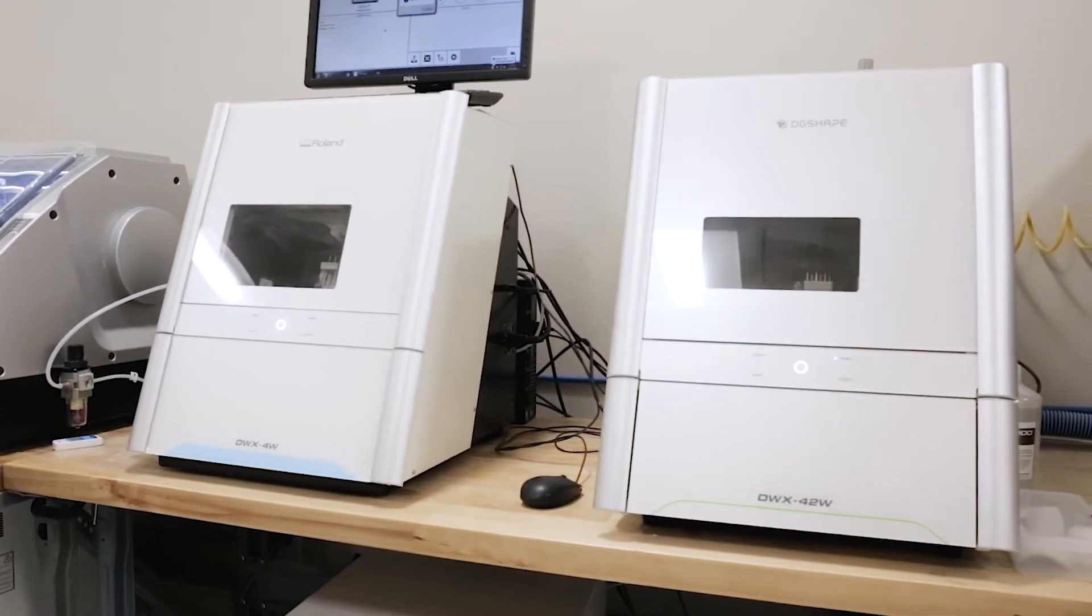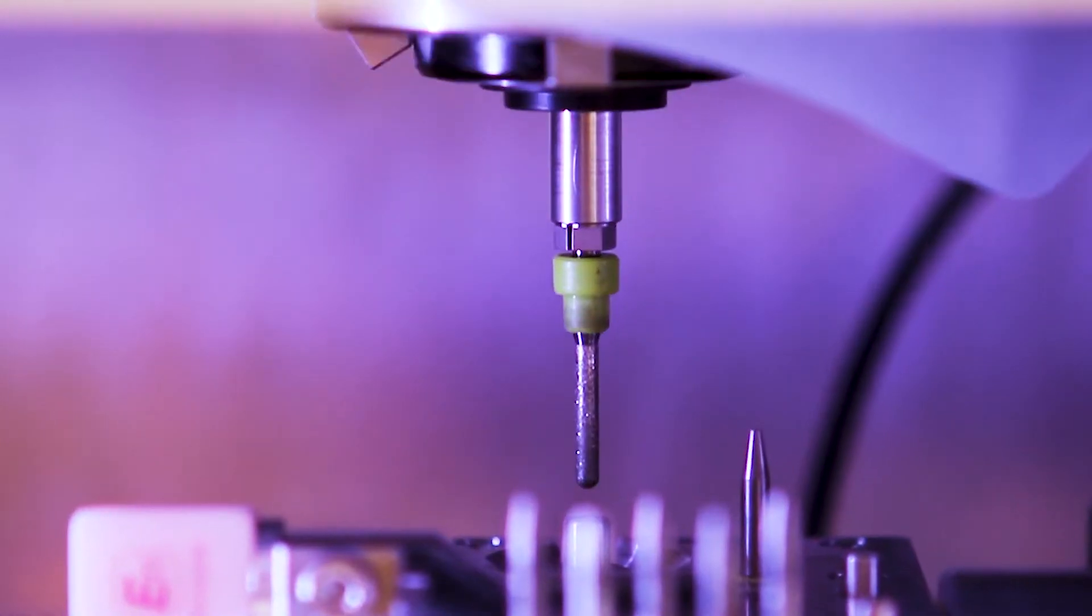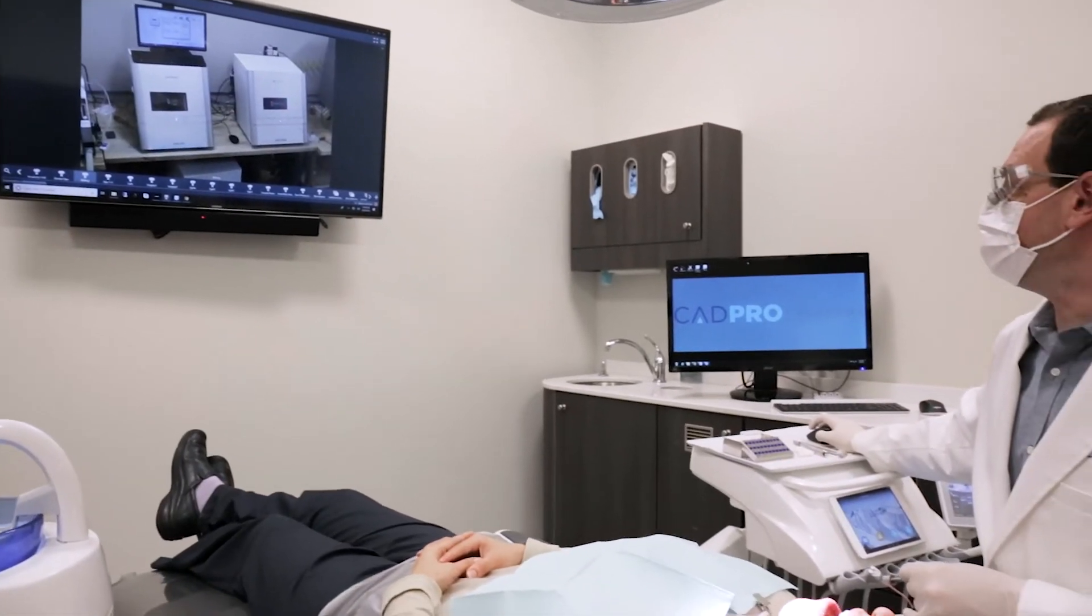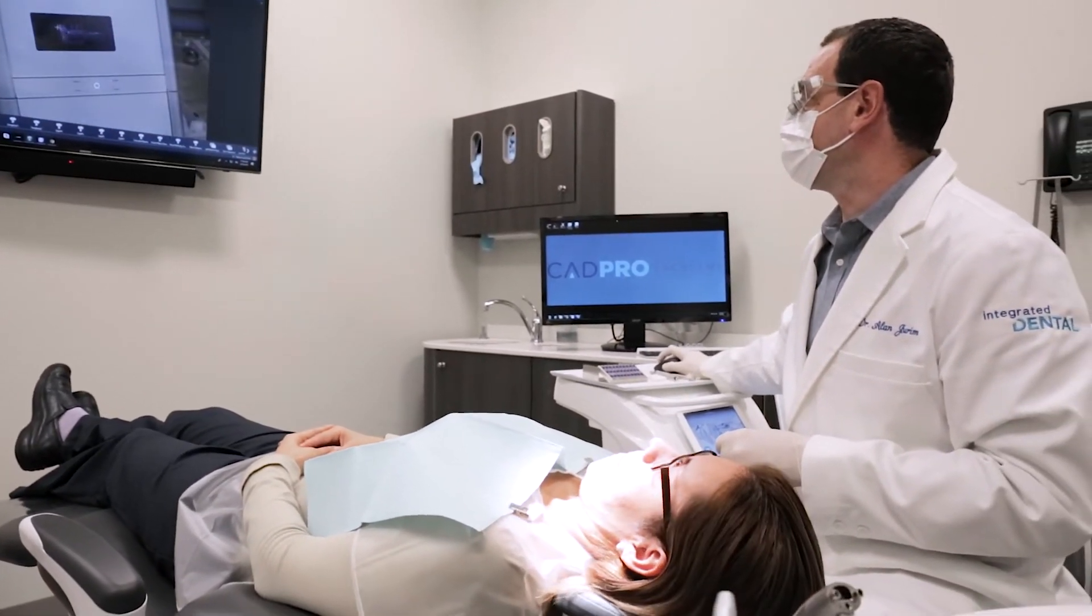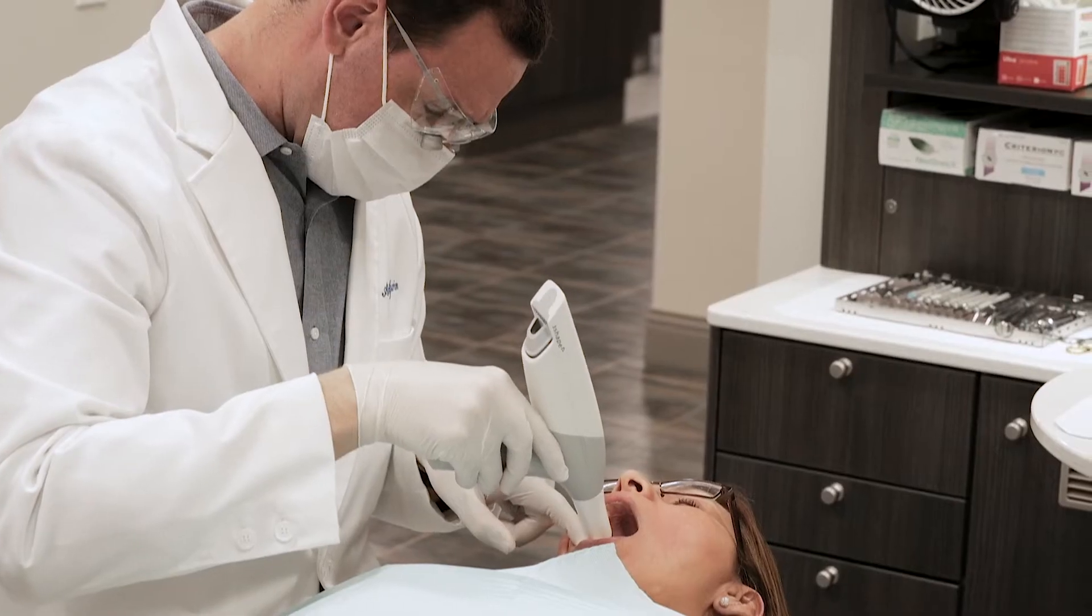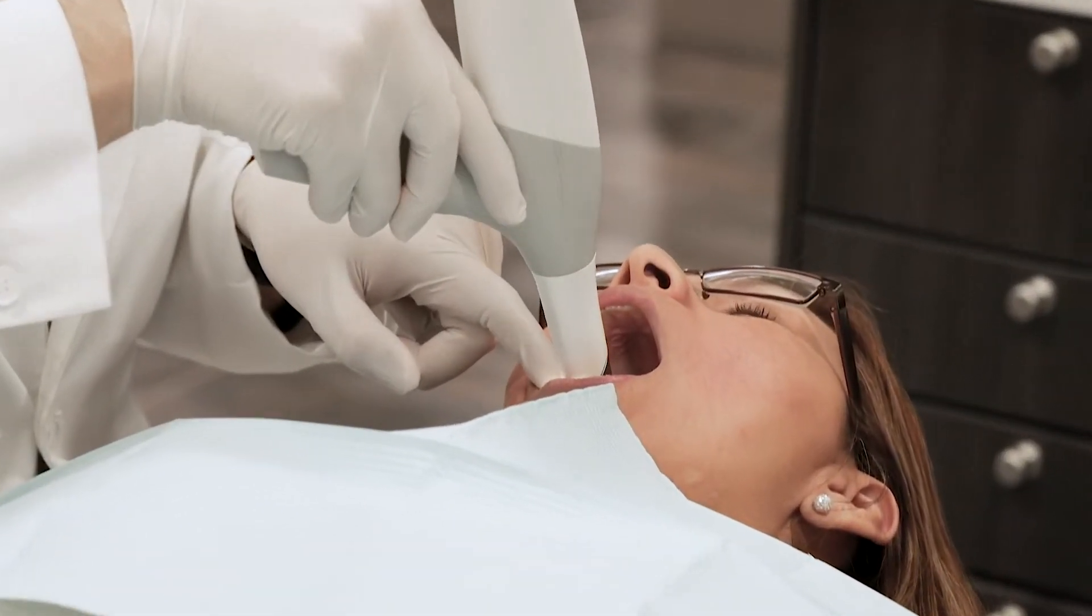One of the key things DG Shape has done compared to some of the other competitors in the field is they've taken a process which can be incredibly complex and made it incredibly simple for us. That simplicity equates to efficiency and profitability.